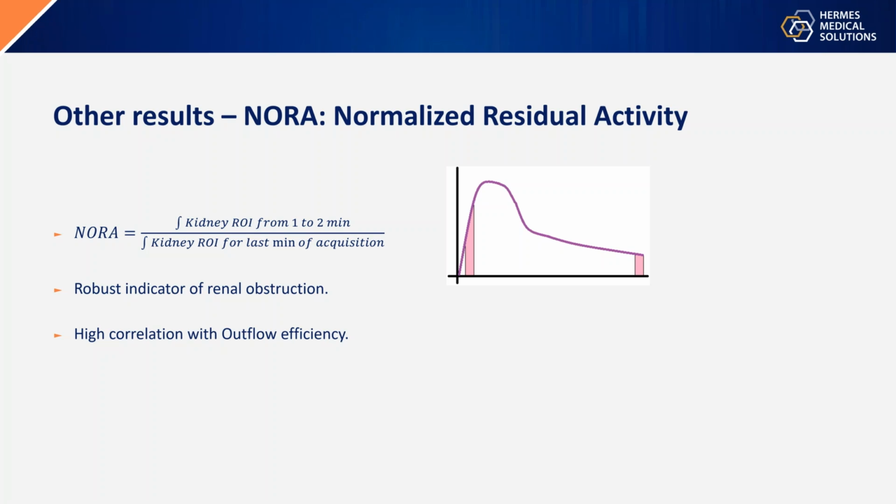Yes, I would say that it is a problem, and that's why the UK community does not really trust the Gates method of clearance. I would agree with you. I feel like we're about to cause some sort of international diplomatic incident here, but great.